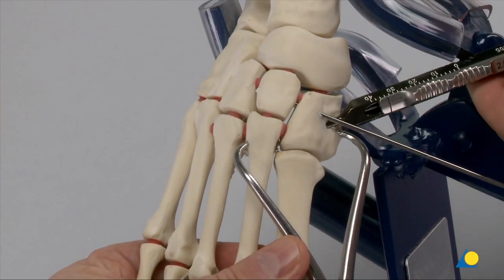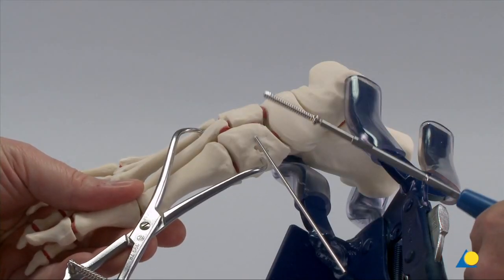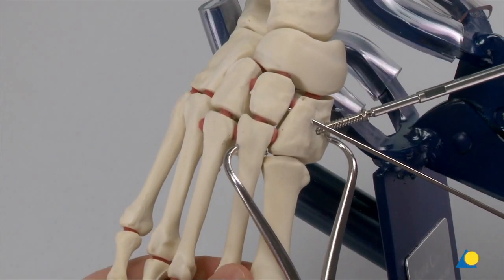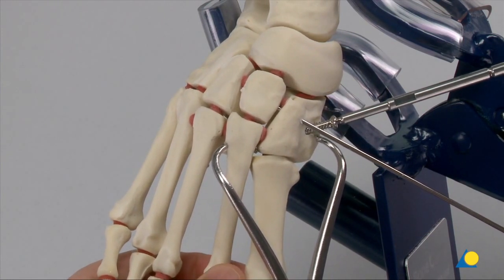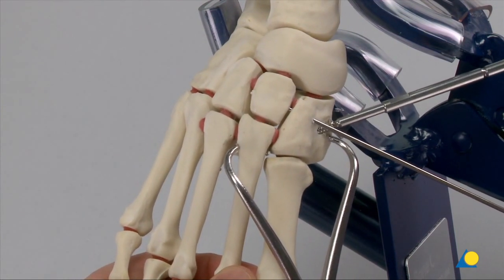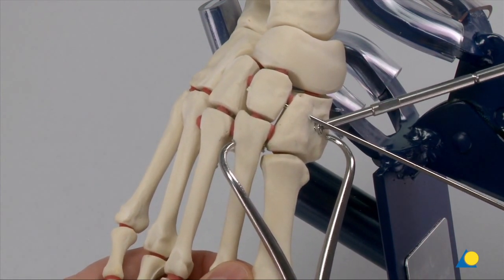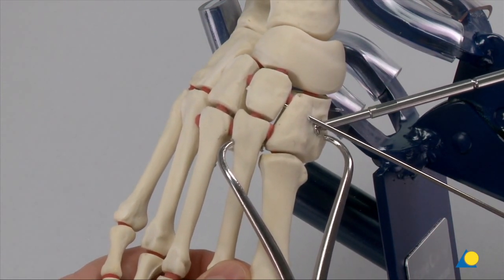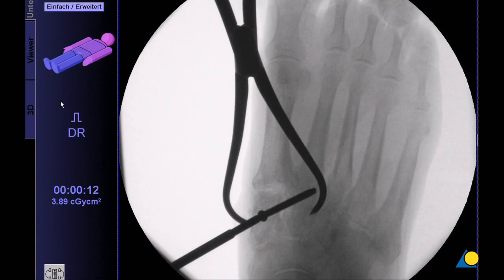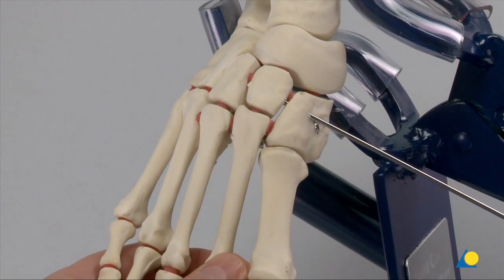In this case, the depth is 34 mm. The appropriate length self-tapping 4.0 mm cortex screw is inserted. As this is a lag screw, the base of the second metatarsal is pulled toward the medial cuneiform. The pointed reduction forceps are then removed.